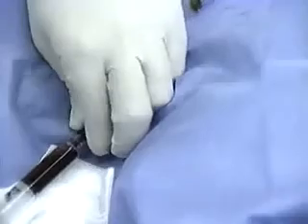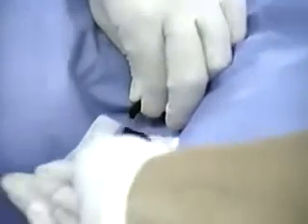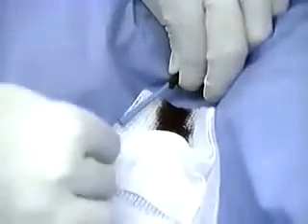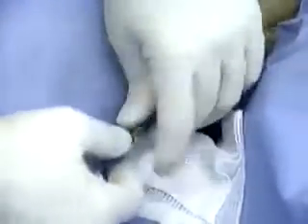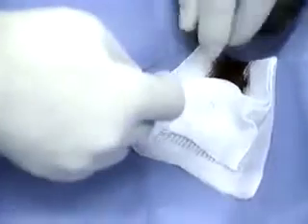The sudden return of dark, non-pulsatile blood indicates you are in a vein. Take off the syringe and advance the guide wire through the introducer needle. Never let the whole guide wire enter the patient. Once the guide wire is in, the introducer needle is removed, leaving the guide wire in place.